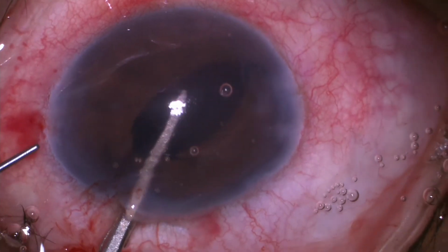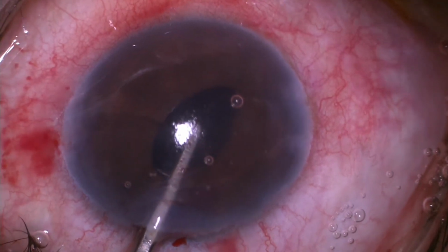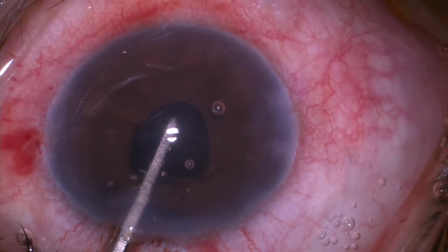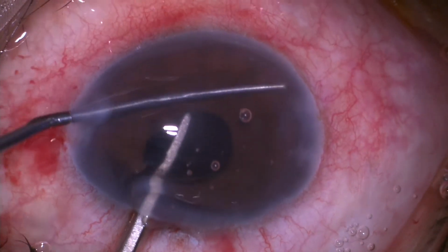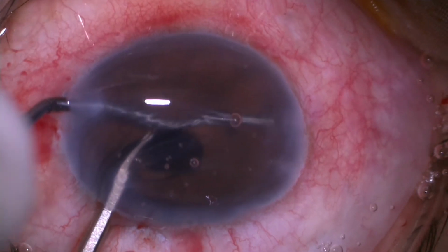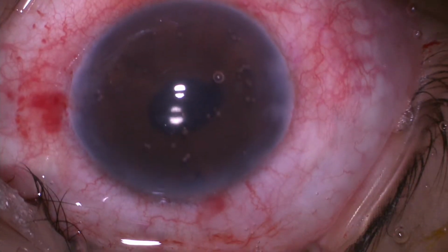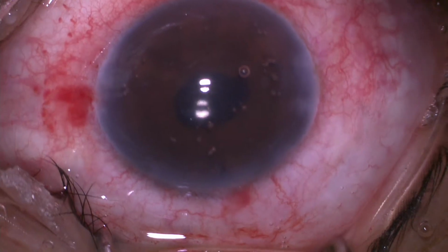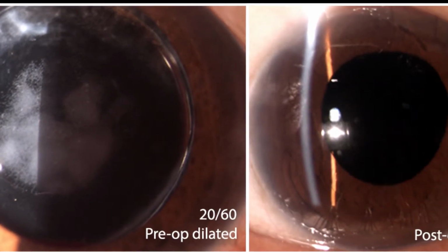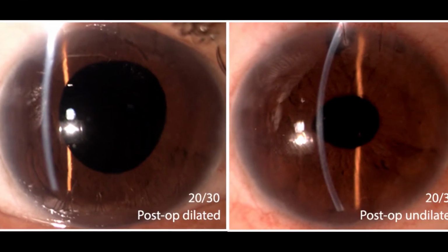Retropupillary fixation of iris claw lens was done by tucking in the peripheral iris tissue. Second claw of the IOL was fixed in a similar fashion. A round pupil with clear optical media and good visual acuity was achieved.